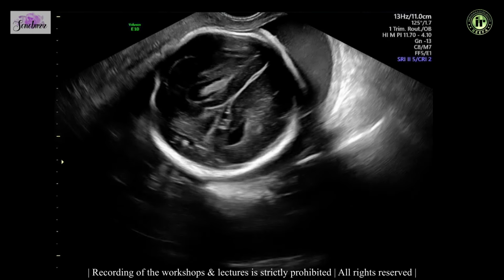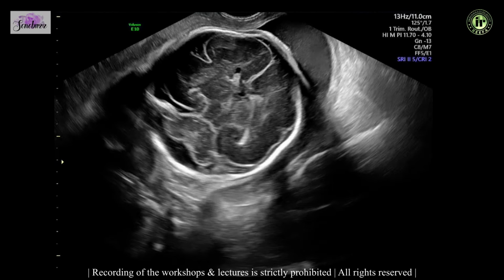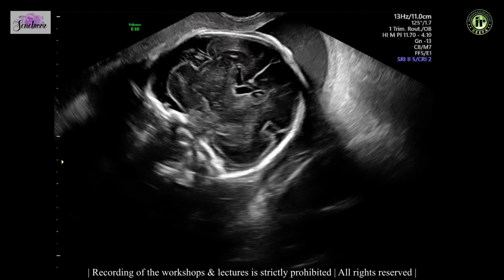And then we go ahead, and these are the bodies of the lateral ventricle. It's a coronal view of the cerebellum here. You can see that's the vermis, and as we go forward we see the thalamus, and that's the corpus callosum. The mid portion, that's the cavum, that's the frontal horns coming up there, and you can see the anterior complex.